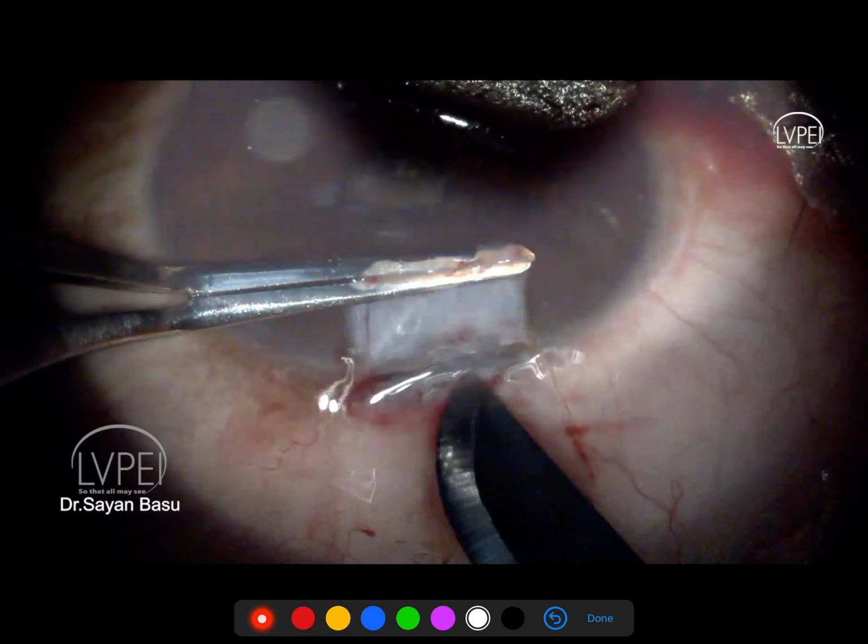Now I will always put a few drops of brimonidine to prepare my cases, both in the donor eye and the recipient eye. It really helps in preventing too much bleeding. Otherwise, when I was cutting the conjunctiva also, there would have been a lot of bleeding, which did not happen because this eye has already received brimonidine. However, the limbal vessels will always bleed irrespective of how much brimonidine you put, and you will see that in the recipient eye also. This happens because the limbus is supplied not only from the episcleral plexus, but also from the major arterial circle of the iris. So there is supply to the limbus from inside the eye also. So the brimonidine doesn't really work on the source which is inside the eye. It only works on the surface. So those vessels blanch, but from inside there is still bleeding.